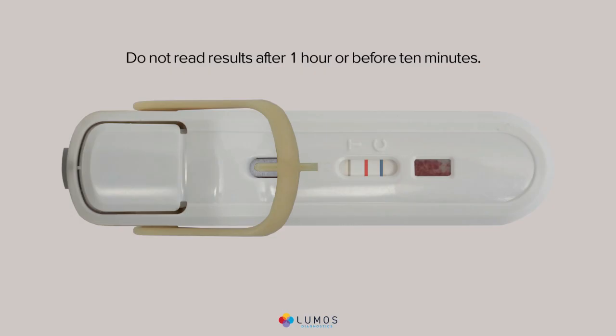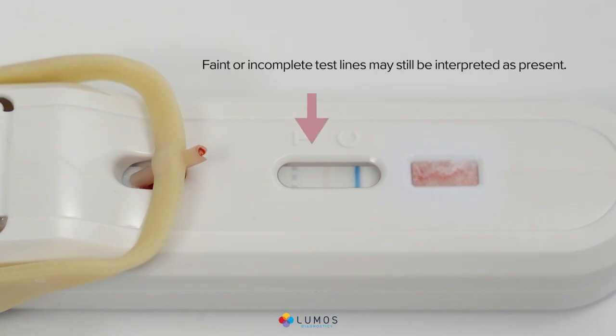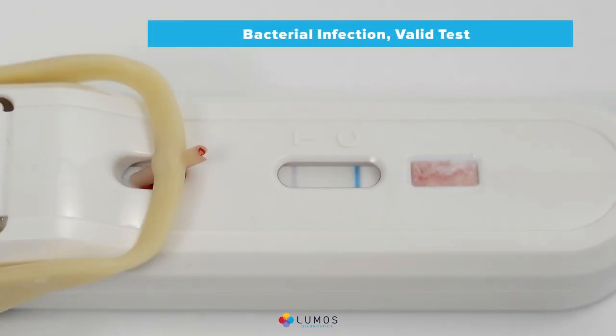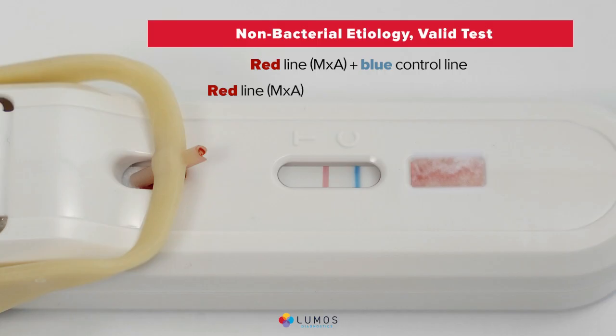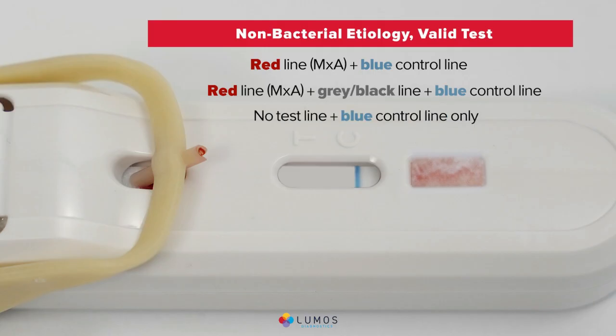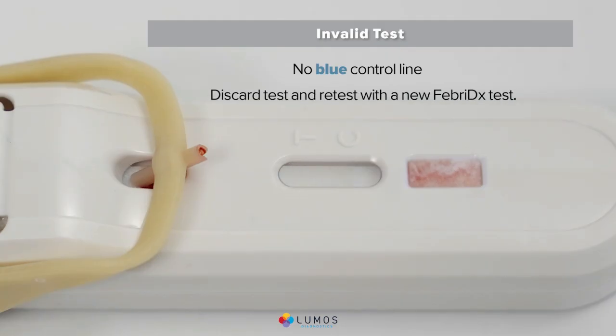Do not read results after one hour or before 10 minutes. Febridex test interpretation: faint or incomplete test lines may still be interpreted as present. A gray-black CRP line plus a blue control line indicates bacterial infection and a valid test. A red MXA line plus blue control line, a red MXA line plus gray-black line plus blue control line, or no test line plus blue control line only all indicate non-bacterial etiology and a valid test. The absence of a blue control line indicates an invalid test; the test must be discarded and the patient retested.